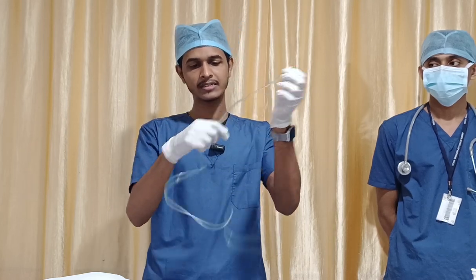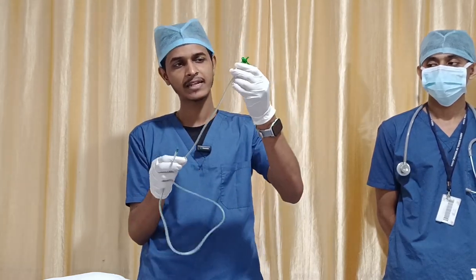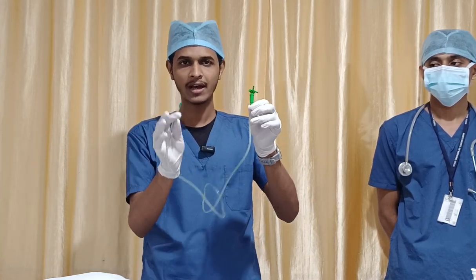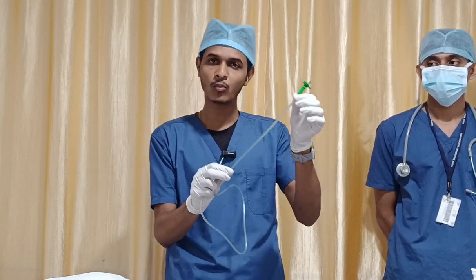Here you can see this is the body, and this is the distal region. In the body you can see the radio opaque line. After insertion, if you take an X-ray, you can see this one black line. That black line is emitted by this green line. This is called the radio opaque line.